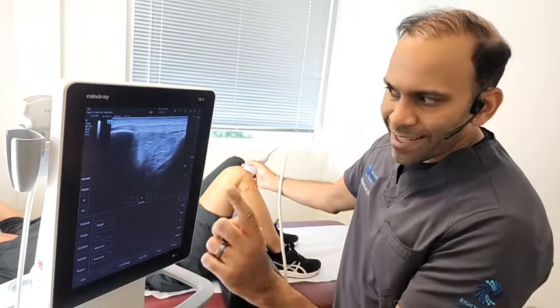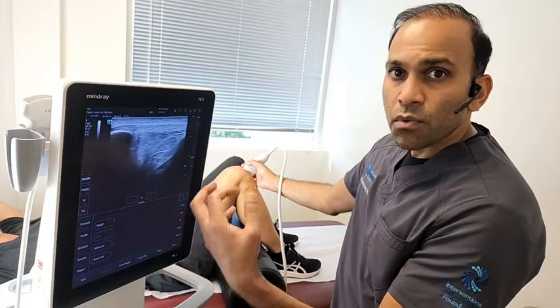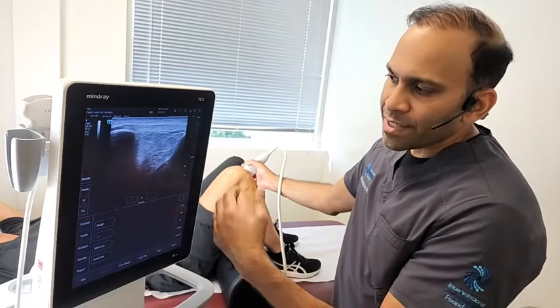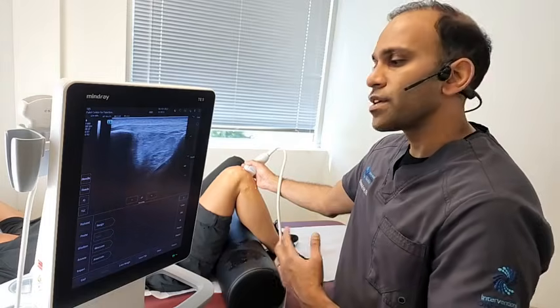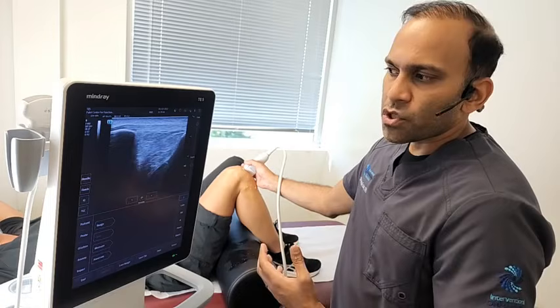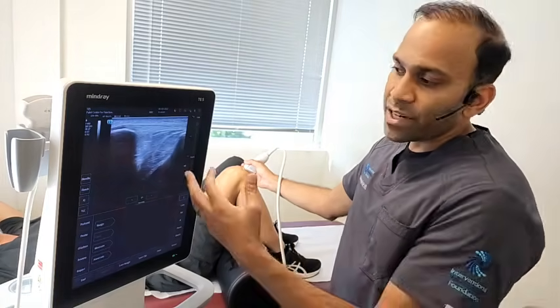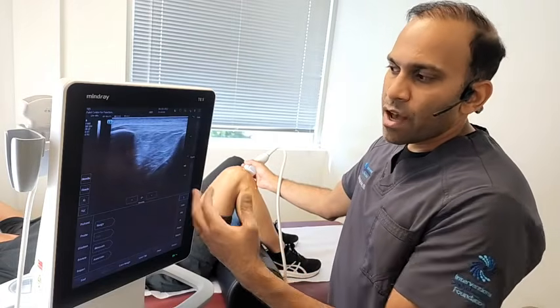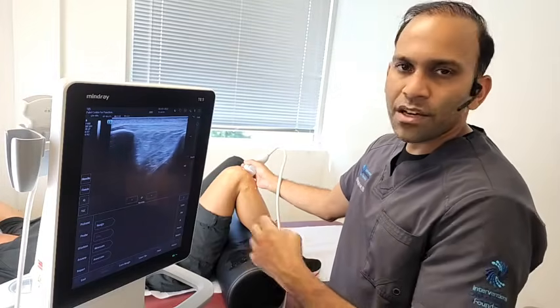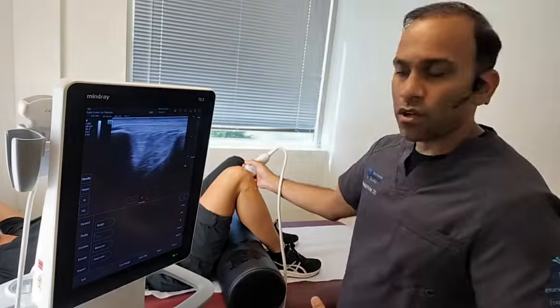Now what we can't see is how far that ACL goes. So the portion of the ACL that connects to the femur, we are not able to see with an ultrasound, but we can tell from this that it at least exists. So when somebody has a potential ACL injury, this could be a beneficial tool if they don't have a significant amount of swelling and they're able to bend their knee. Then we can actually see, is that ACL still there at all in any way, shape, or form? We could even see sometimes if there's a tear in this part of the ACL or if there's any swelling or issues around that. A little bit more of an advanced maneuver when looking at ultrasound.